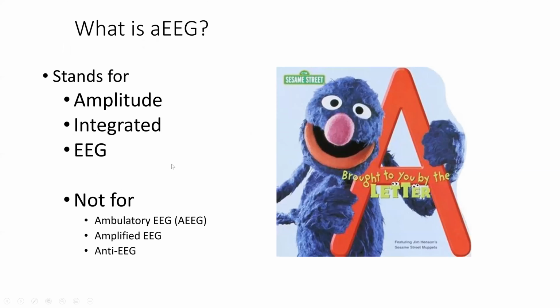We throw around this word aEEG or CFM, cerebral function monitor. We throw them around, but what do they really mean? They really stand for some pretty specific things, and I want to make sure that we all have an understanding of that as well.